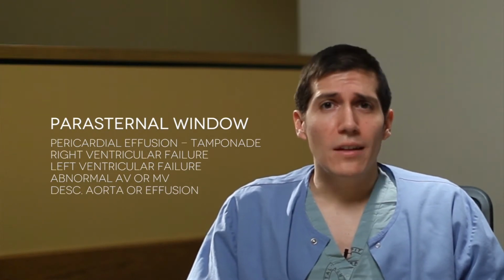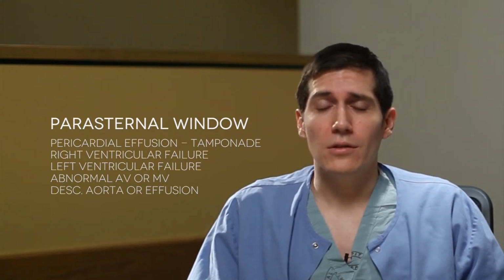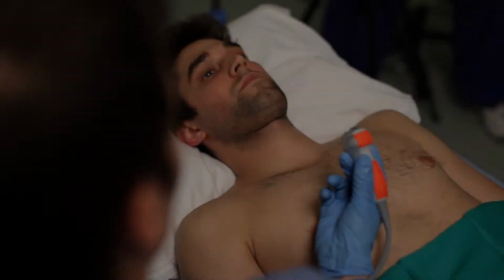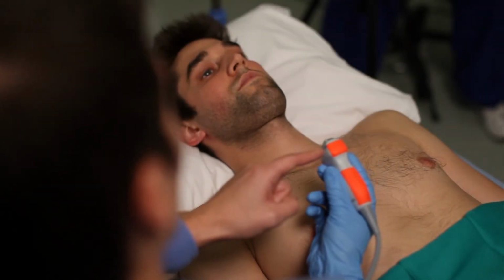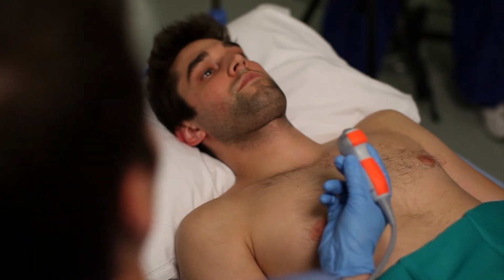Finally, to be able to make these diagnoses and acquire this anatomy, you have to be able to acquire the image. Let's get to it. I want you to notice the difference on the probe is that I have marked the indicator notch with orange tape to make it easier for you to be able to visualize.